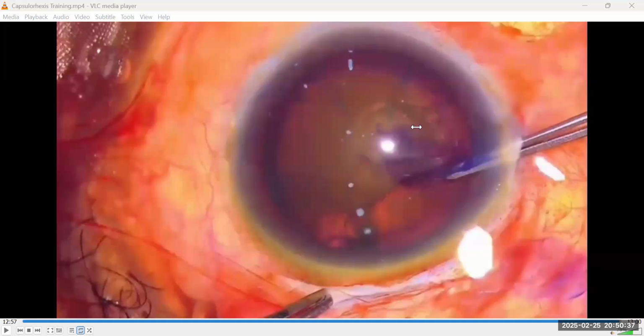The reason is simple. If you are advancing your rhexis to a 6mm perimetry, remember, the surgical anatomy and the depth there is very small. And if you're losing visco alongside, you might actually be rubbing the knuckle on the endothelium. It's just a safety measure, please.